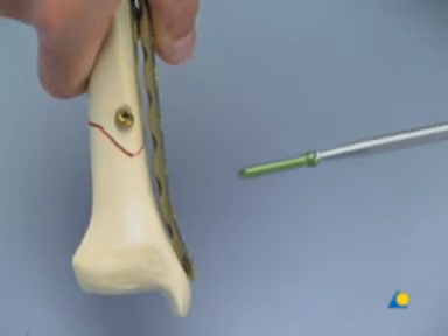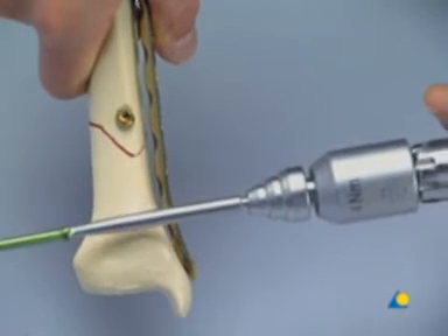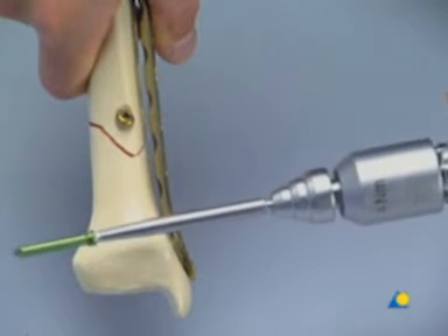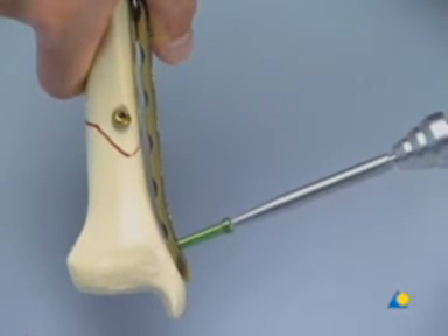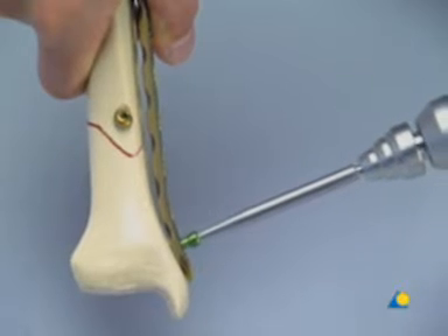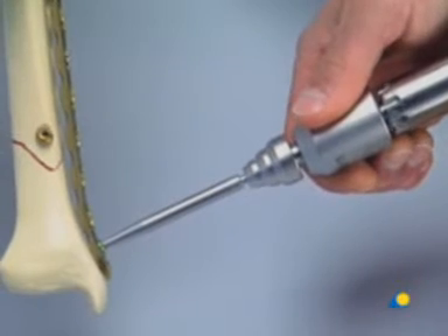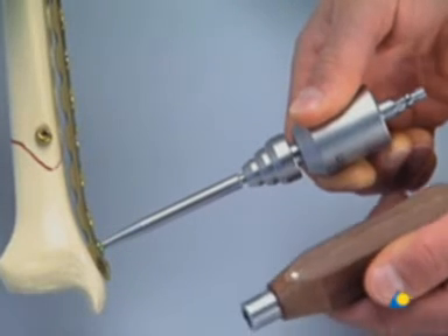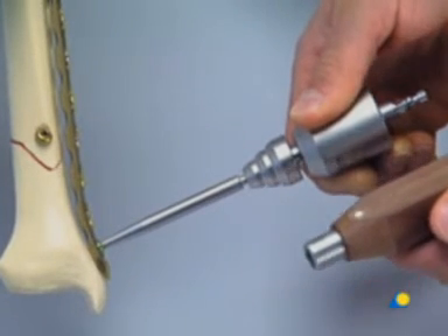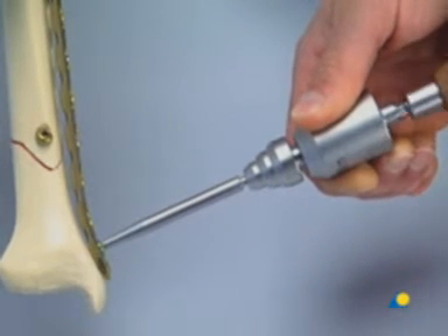The green self-tapping locking head screw is inserted with the torque-limiting screwdriver attached to the power drive. The last turns have to be done by hand to prevent the thread from jamming, so the power drill is exchanged for the handle of the screwdriver.